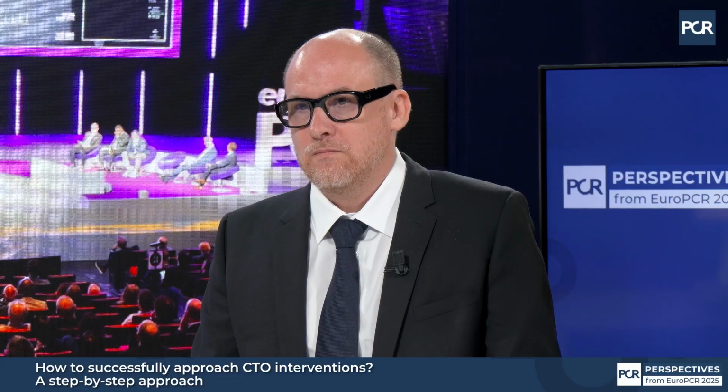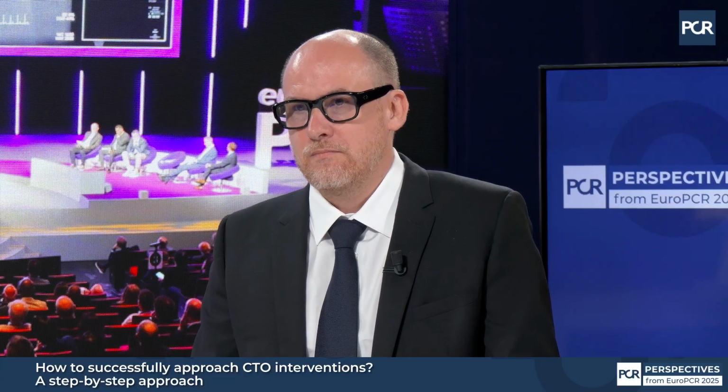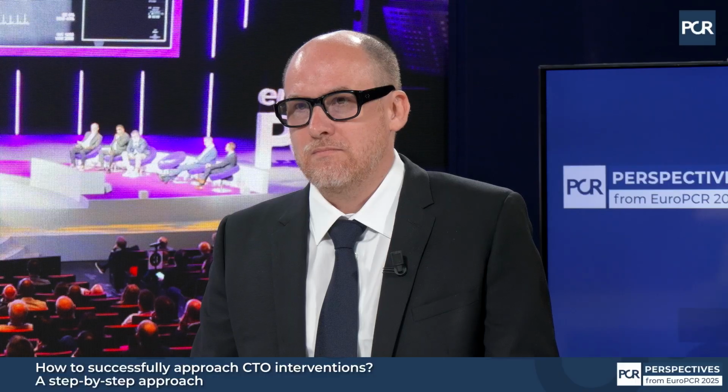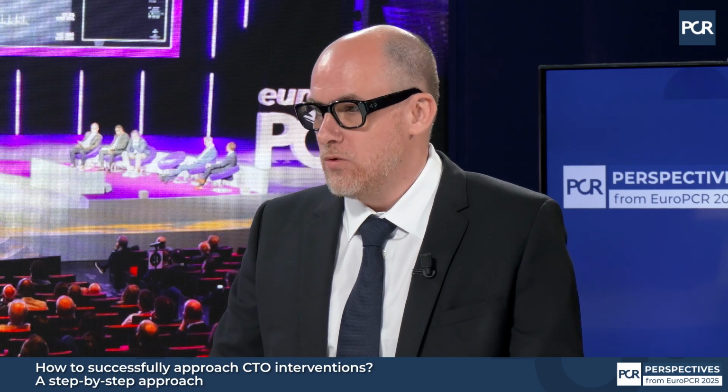So Thomas, CTO can be somewhat overwhelming and potentially complex. What do you think are the very first steps to get started on the road to approaching any given CTO case? Thank you, Elliot. So I think my first advice for a new CTO operator would be to do a very good and specific angio, which is not the same as a standard angio. I will make some more views.